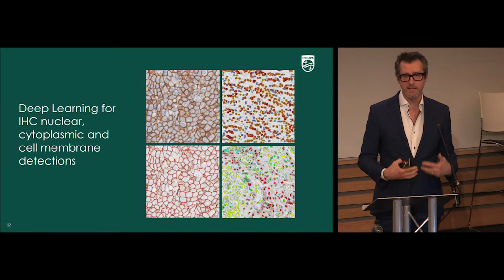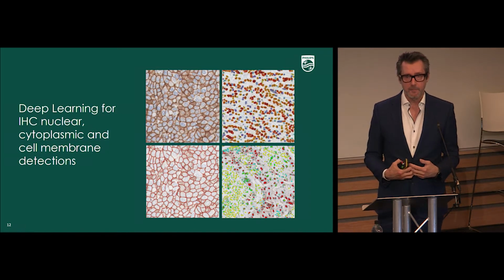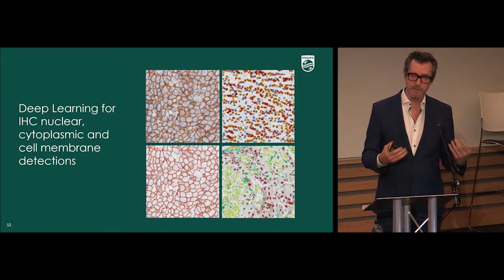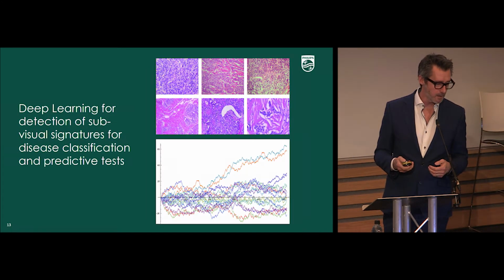And certainly in our hands, we're beginning to see that deep learning can significantly outperform conventional machine learning or segmentation classical imaging approaches.